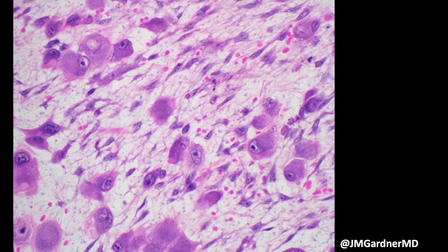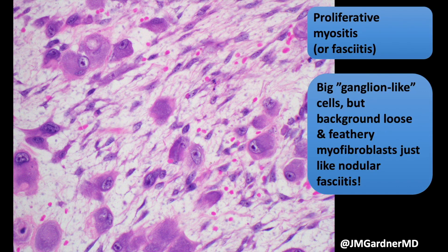What about these wild-looking cells? These big cells are kind of the exception to the rule — they're atypical — and you can see them in the setting of a background that looks like nodular fasciitis. We have a loose myxoid background with extravasated red cells, spindle and stellate myofibroblasts, and then these big ganglion-looking cells. When these ganglion-like cells are abundant, you can call this proliferative myositis if it's in the muscle, or proliferative fasciitis.